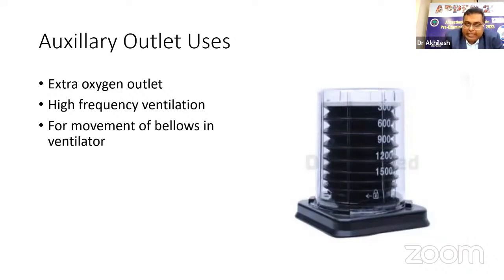Now you'll recall one thing, that whenever there is a fall in pipeline pressure and we open up the cylinder, the technician always asks us to take the patient on hand. Don't ventilate through the ventilator. Because if we ventilate with this ventilator through the cylinder, then with every breath 500 ml of oxygen is getting wasted. So whenever you are using a cylinder, avoid using this bellows system.